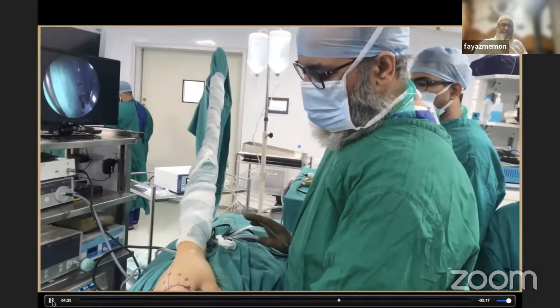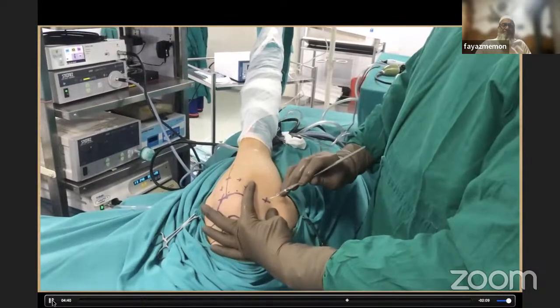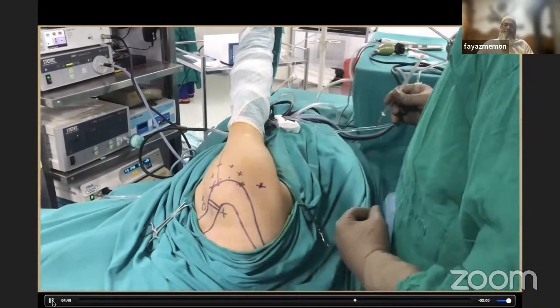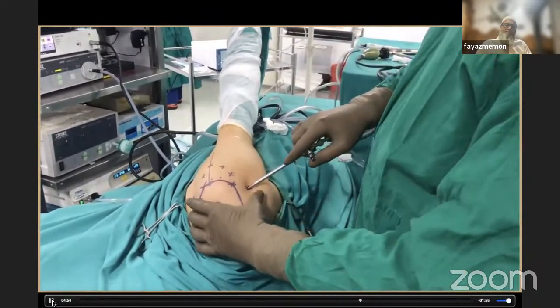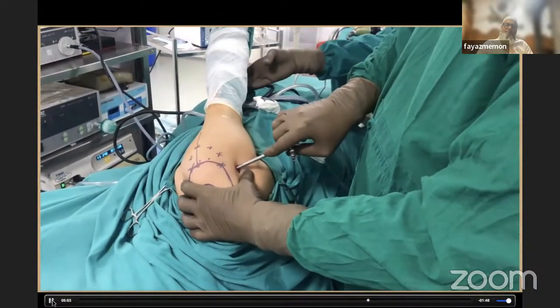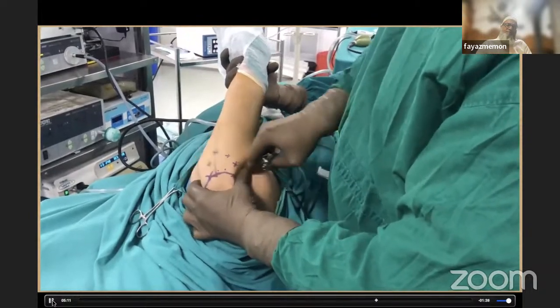Before taking the incision, always try and palpate the humeral head, so you have an idea as to where the glenohumeral line is over here. In this case, we are right at the point. So just take the incision deep enough to reach the muscle. Then just go inside by twisting force, rotate, and reach the glenoid. Now I can feel the glenoid and the humeral head over here. Little abduction, move, and just enter the joint.